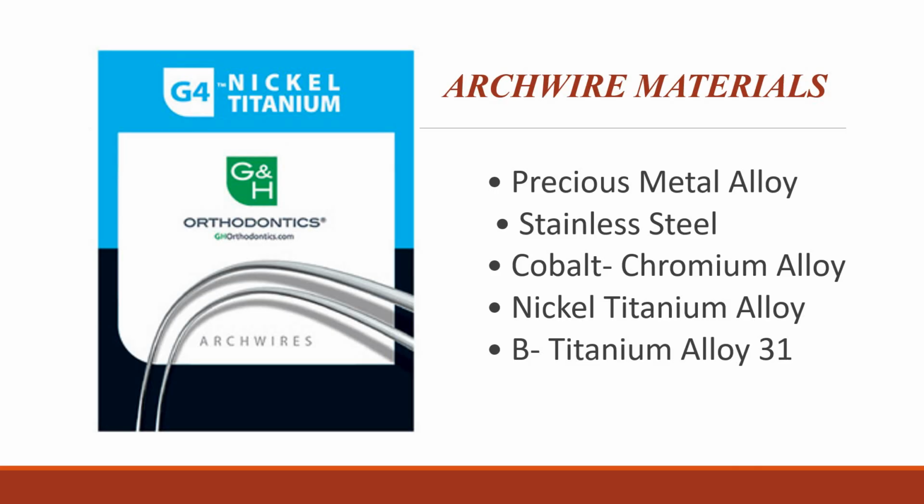The particular sequence that an orthodontist chooses is often down to personal preference. Tooth alignment during the initial stages of treatment requires the following properties: large spring back, low stiffness, high stored energy, biocompatibility, and low surface friction.